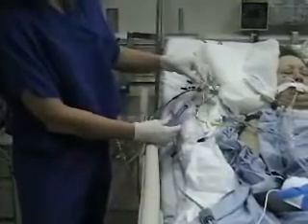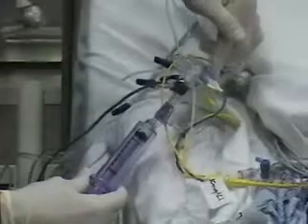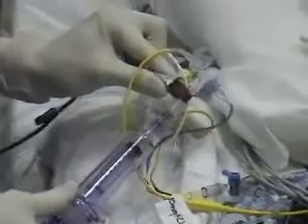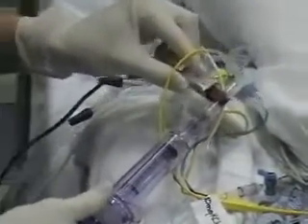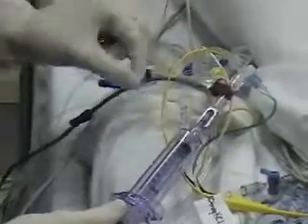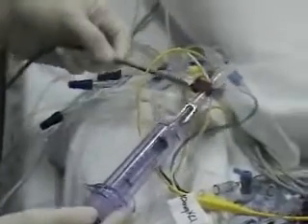Then you need to come over here and find your injectate, and be sure that it is connected to your proximal injectate port — your CVP port or your proximal PA port. It is generally iced for most thermodilution cardiac output measurements. You will need to make sure that a temperature probe is attached to the side of that, to ensure that the monitor can interpret the temperature of the injectate against the patient's core temperature.